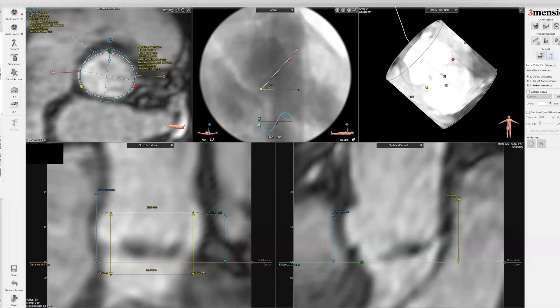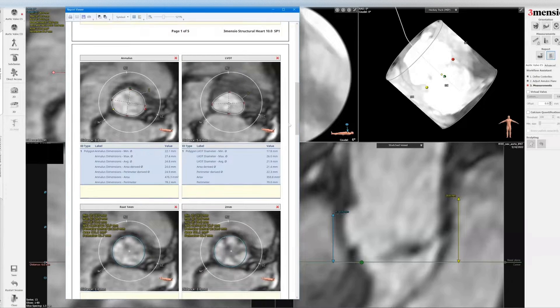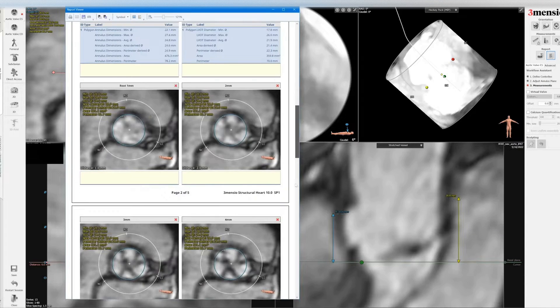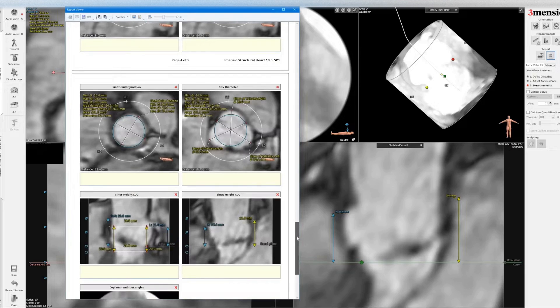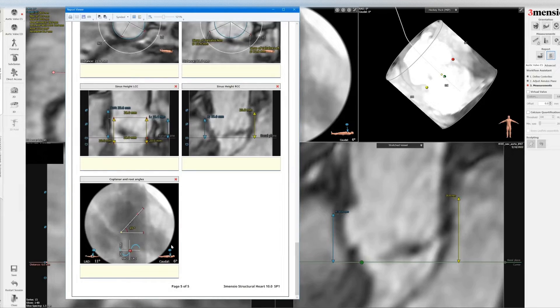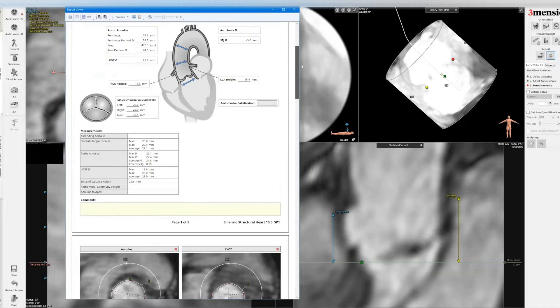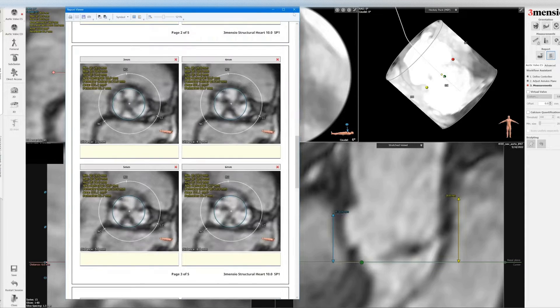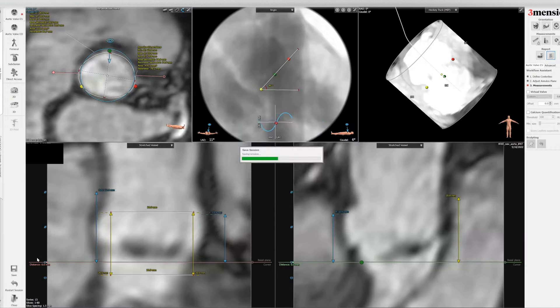Let's take a look at the report. You can see you have the same kind of report layout: annulus, LVOT, the one millimeter cuts, STJ, sinus of Valsalva, left main, right coronary height, and finally the root angle and the implant angle. You can correlate this for non-contrast CT. You can save this to a PDF and share with your heart team, and of course you can also save the session for future reference.